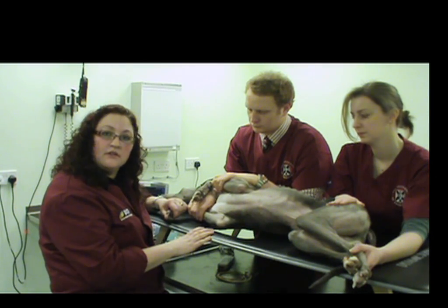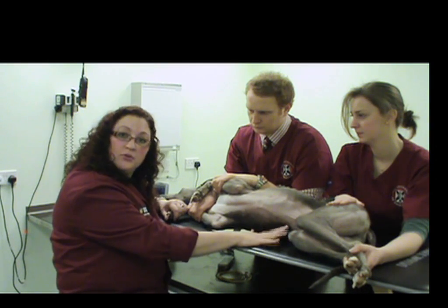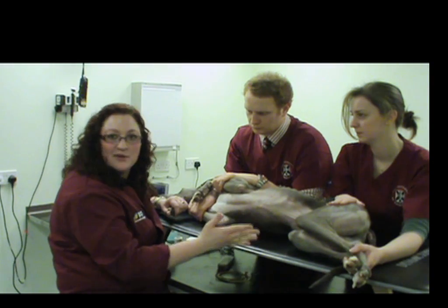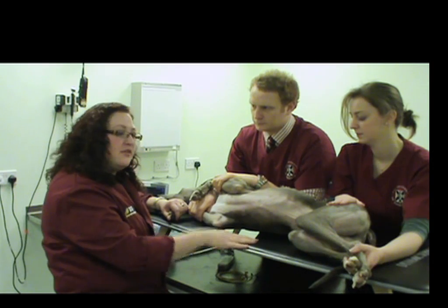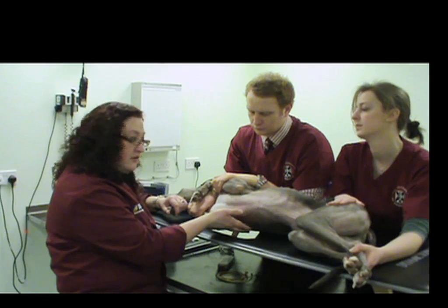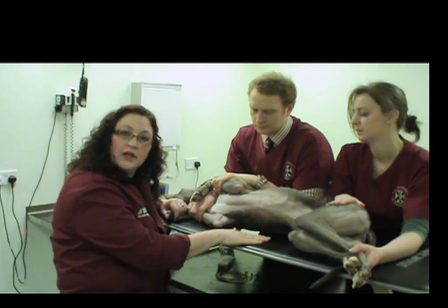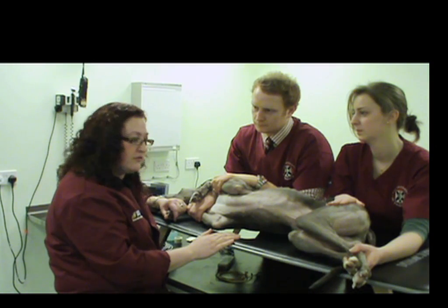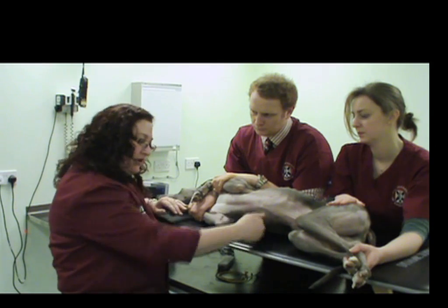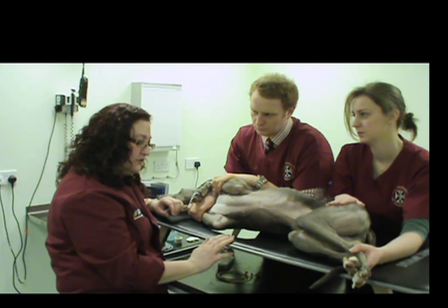The other things we need to consider are the actual pieces of equipment. We need to look at what type of table we will have. This is a dedicated cardiac ultrasound examination table, but not everyone will have this. The most important thing is that you want access for your probe to reach the heart where you're wanting to perform the exam. If you don't have a table like this, there are many manufacturers where you can purchase them, but some people have used a piece of wood with a hole cut out to gain access to the dog.